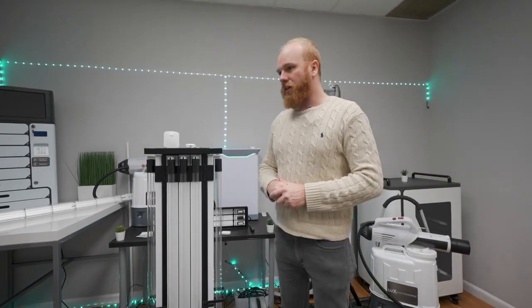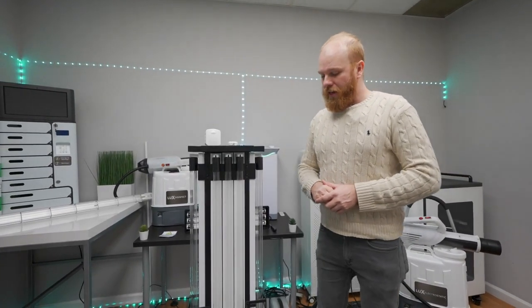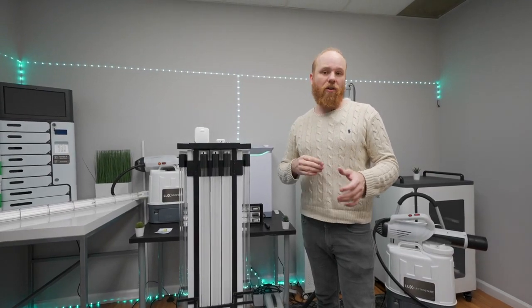Devices like this UVC Ultra tower or any of our other UVC disinfection equipment allow you to quickly, safely, and efficiently disinfect spaces without the need for liquid or harmful chemicals.